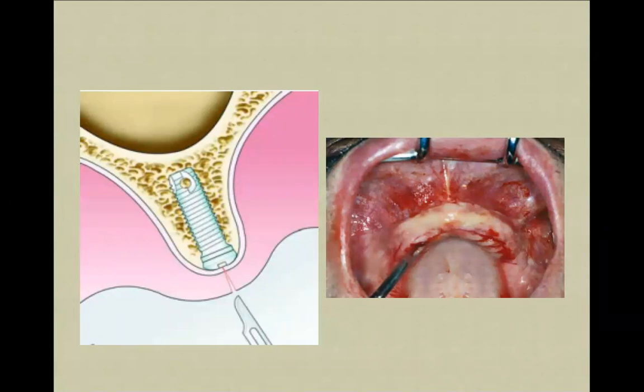I'm doing local anesthesia only, except palatine nerve block and incisive nerve block for the maxilla, and again, not because of importance, but just because that has some sense, to reduce the amount of anesthetic solution.